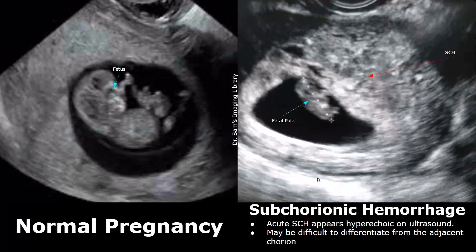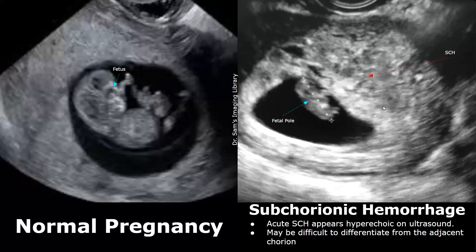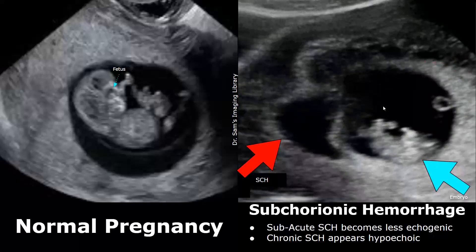An acute subchorionic hemorrhage, or SCH, appears hyperechoic and heterogeneous because of fresh clotted blood. Clotted blood appears hyperechoic. It can be difficult to locate this hematoma when it is at an acute stage. Over time, the echogenicity of the hematoma starts to decrease. A subacute SCH becomes less echogenic. A chronic hematoma will appear hypoechoic due to liquefaction and resorption of the hemorrhage.